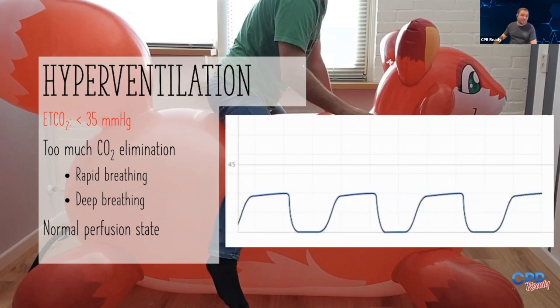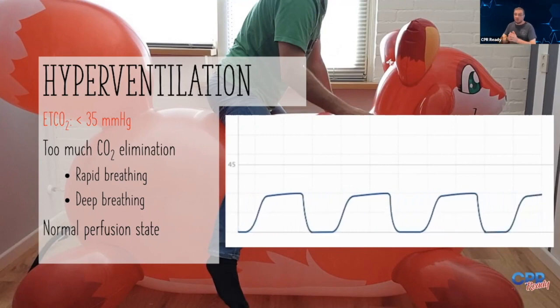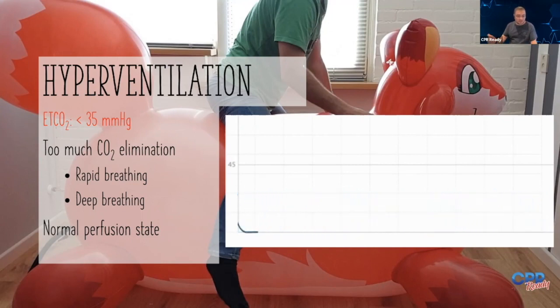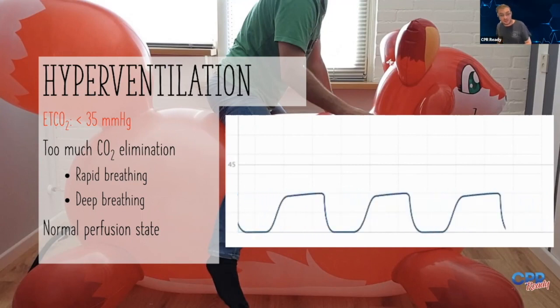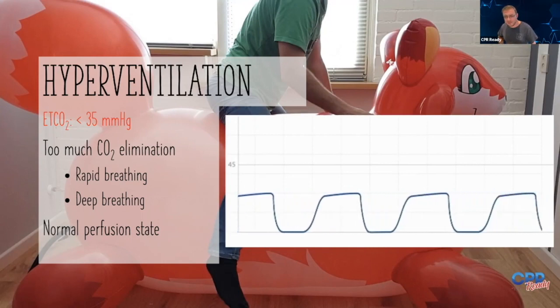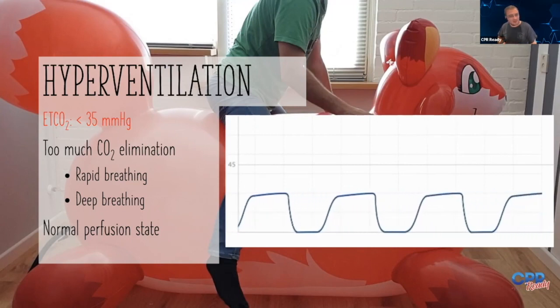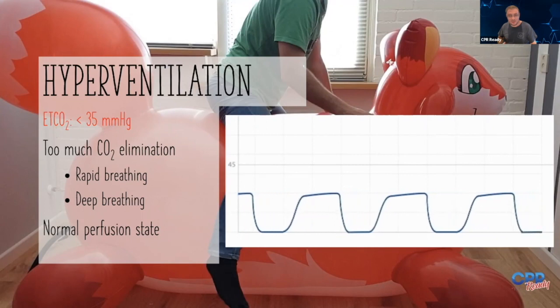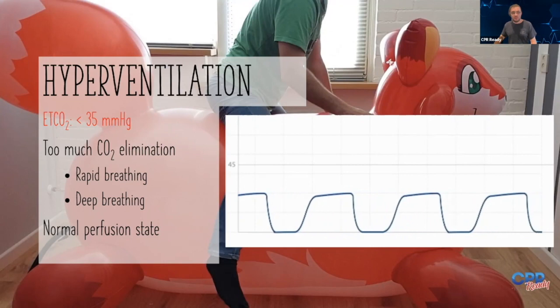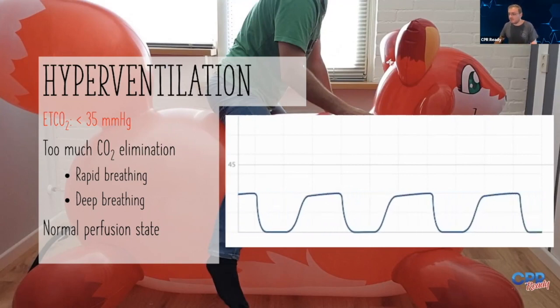And sometimes you can have deep and rapid breathing in a combination. So it can be low for a bunch of other reasons too. And so we're going to talk about that. But remember, CO2 gets produced through cellular work, through perfusion. So if you have a low end-tidal CO2, but you have what appears to be relatively normal breathing, then you have to ask yourself, what's causing it to be low? Is it just because they're hyperventilating, or are they simply not producing the CO2? And there's another problem there. So don't just assume low end-tidal CO2 is a lung problem. It could be something different. We'll talk about that in a little bit.